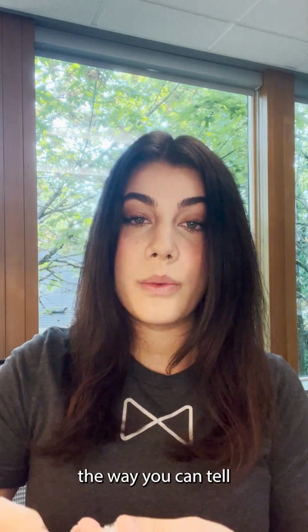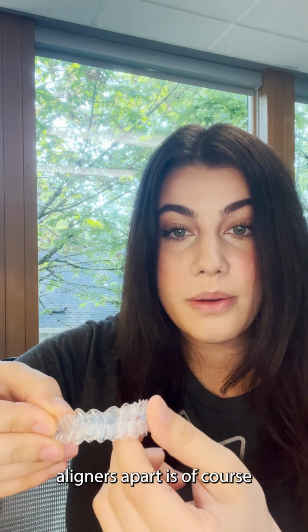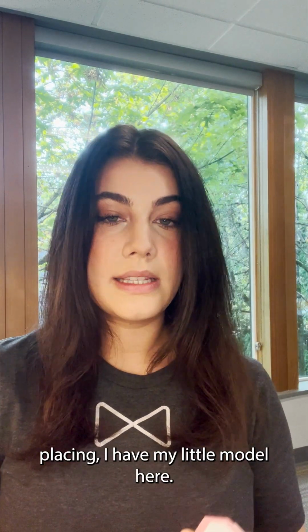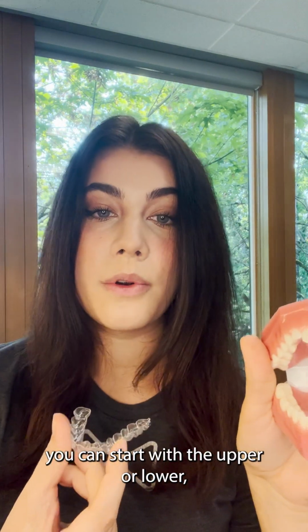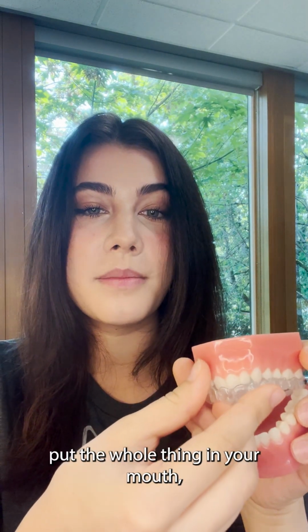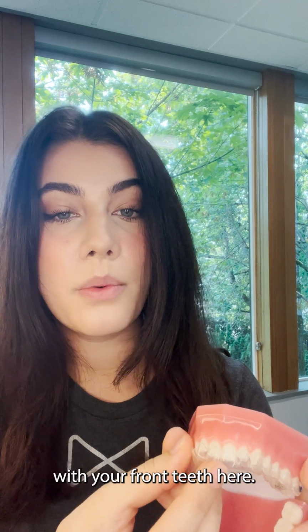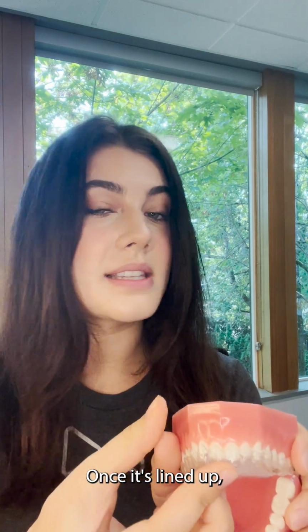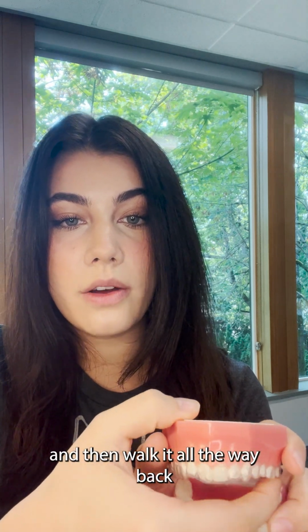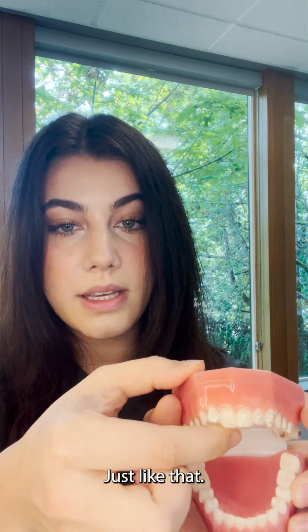First thing here, the way you can tell your upper and lower aligners apart is, of course, your upper front teeth are wider than your lower front teeth. So that just makes it easier to tell the difference. So as far as placing, I have my little model here. What you're gonna do, you can start with the upper or lower, whichever you prefer, and just take the aligner, put the whole thing in your mouth, then lining it up with your front teeth here. Once it's lined up, you'll just want to push all the way up, starting in the front, and then walk it all the way back with your fingers, just like that.